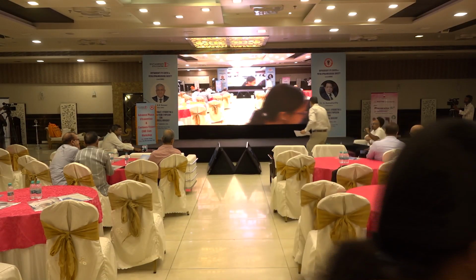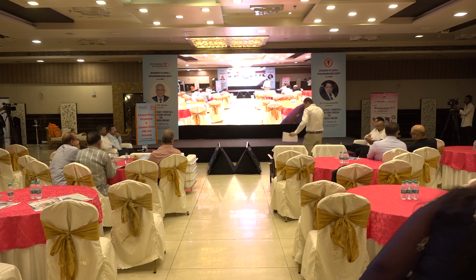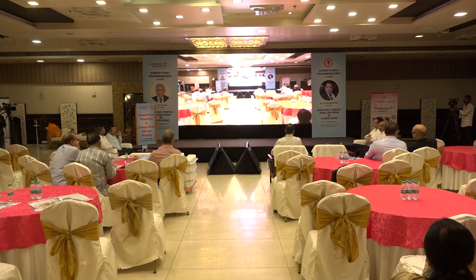When do we intervene in such types of cases? Yeah, since it's a case of trauma, Terson's syndrome, there's hemorrhage in the brain also, there's vitreous hemorrhage. So once the condition of the patient stabilizes, and we see that the vitreous hemorrhage has not resolved over a period of 1 month, then I think there's no point in waiting. As you can see, the color of the blood has also changed so much, from red it has become dark brown. So it's not going to resolve on its own. So definitely, after waiting for 1 month, there's no point in waiting beyond that. And once the systemic condition of the patient stabilizes, the patient can be taken up for surgery.